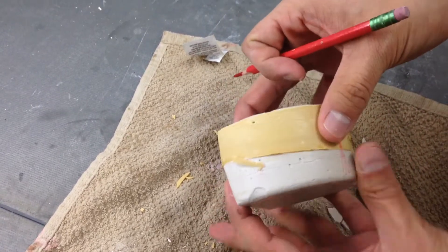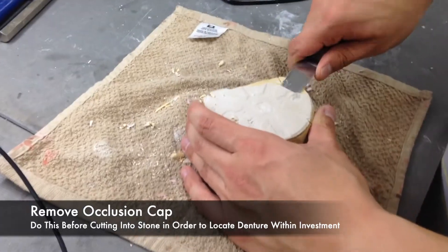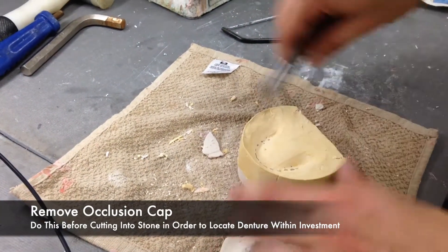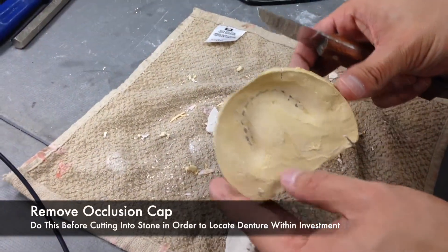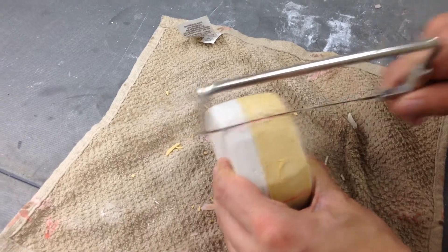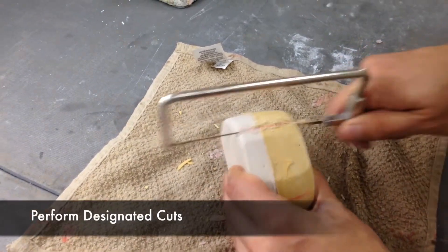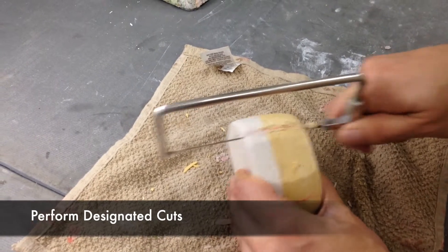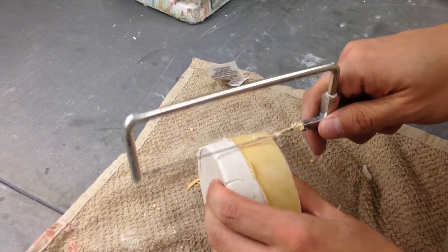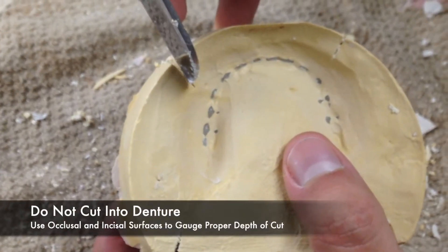Before starting your cuts, always remove the occlusion cap of your stone investment. This will show you your incisal and occlusal surfaces that you freed during your flasking procedures. The occlusion cap is critical to de-flasking. With the cap removed, you can now view all incisal and occlusal surfaces of the denture, which allows you to locate the denture within the investment. This aids in preventing you from cutting too deep and damaging the denture base or the denture teeth.